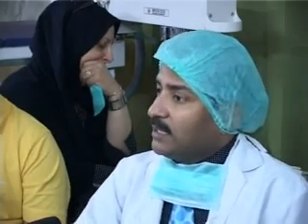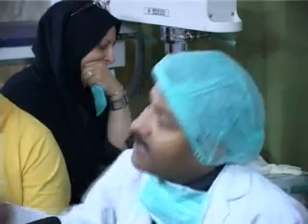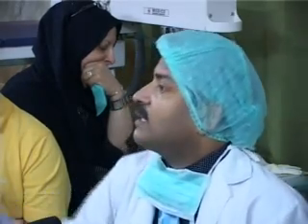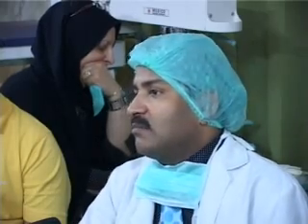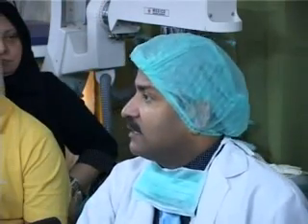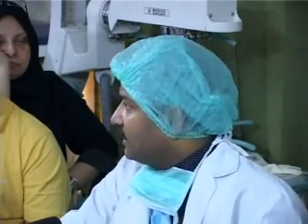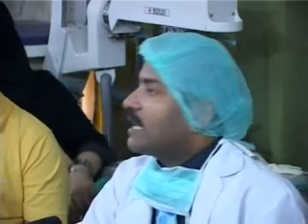But using a CO2 warmer means you are keeping it outside and drying it with a hair dryer, meaning you are pushing warm air over it. In laparoscopy we cannot see it at that time, but it gives such bad adhesion, sometimes very long duration paralytic ileus, and sometimes, rarely, fistulization and obstruction can also happen.